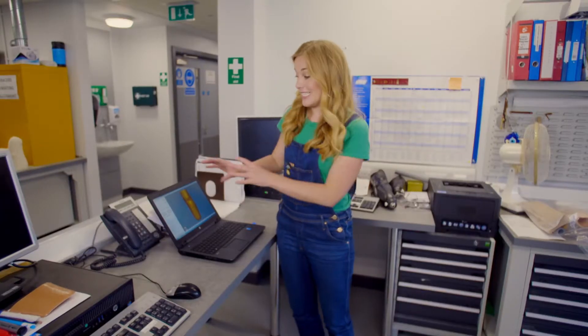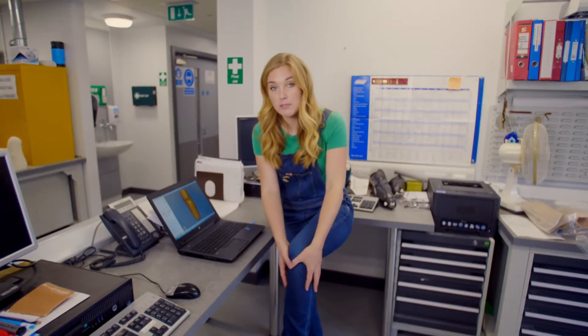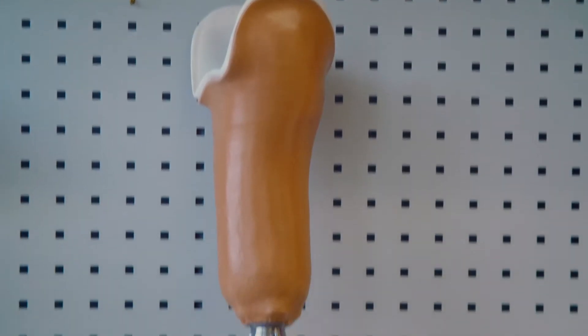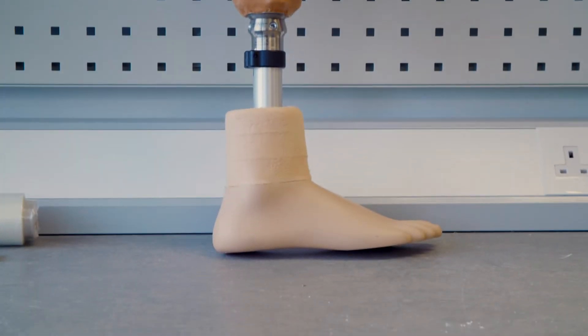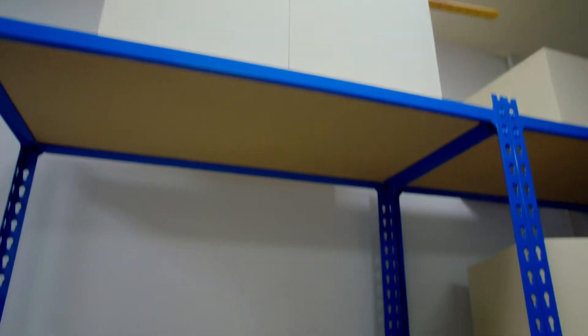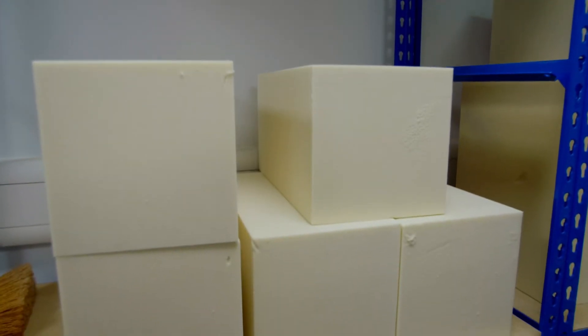And the prosthetic leg we're making today is going to fit just below the knee and then there'll be a shin and a foot at the bottom. The model will be made from one of these foam blocks.